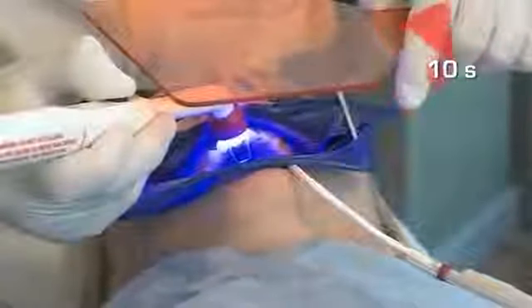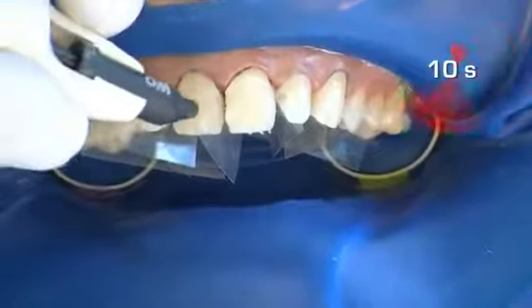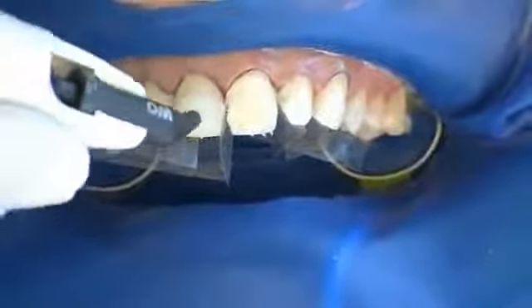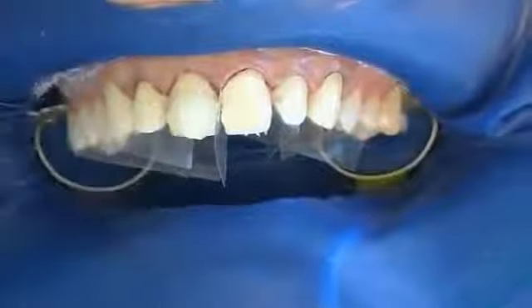Separators are now placed to ensure clear tooth access. Each tooth is pre-cured for 10 seconds. The selected luting composite is applied directly to the tooth and evenly distributed; at the same time, the Componeers are prepared by the nurse.